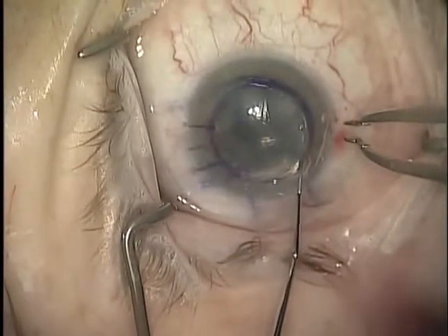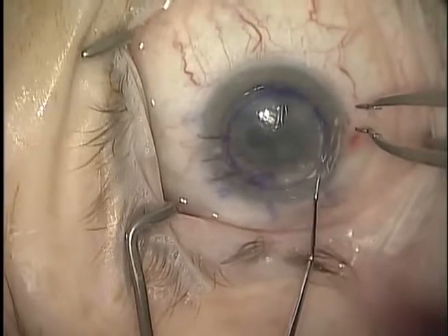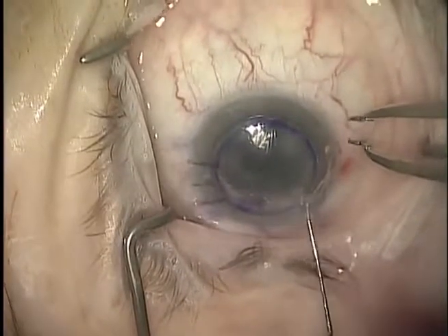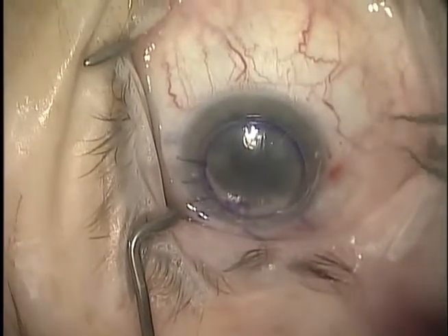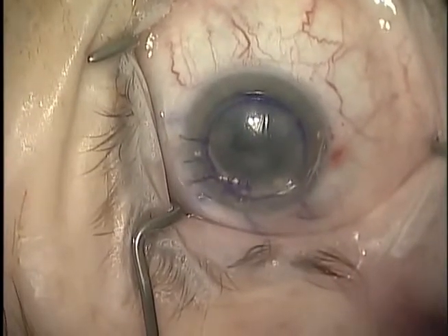The patient will then remain supine for 60 to 90 minutes, at which time a small amount of air is removed if necessary to prevent pupillary block. The patient will remain supine for the next 24 hours and be evaluated the following day.